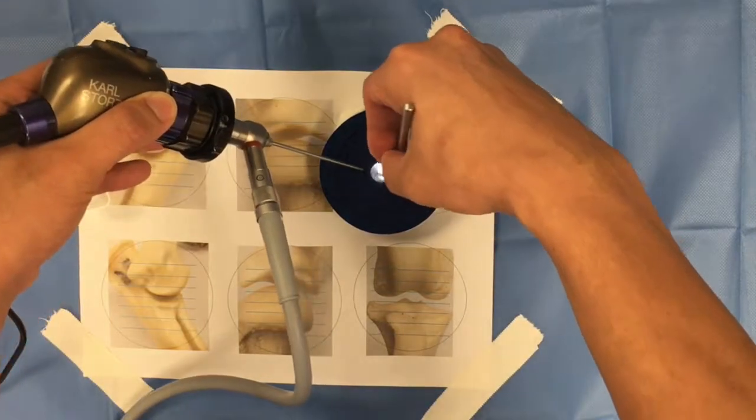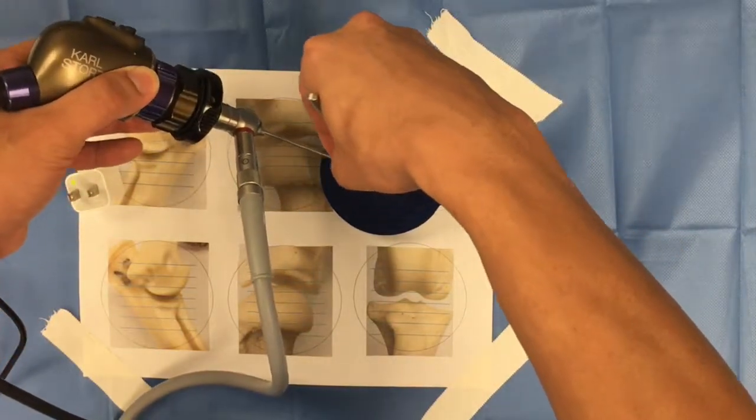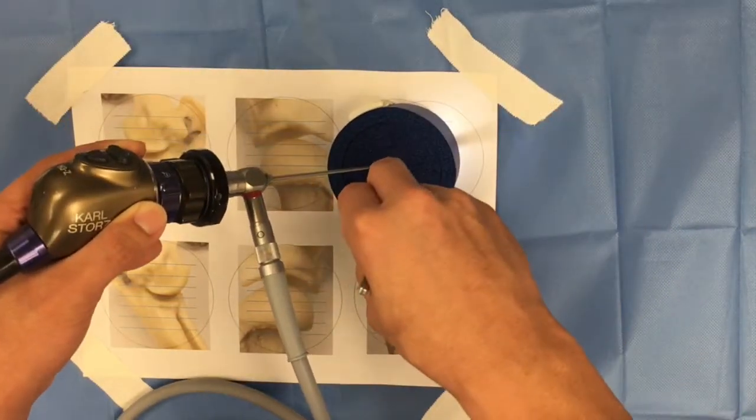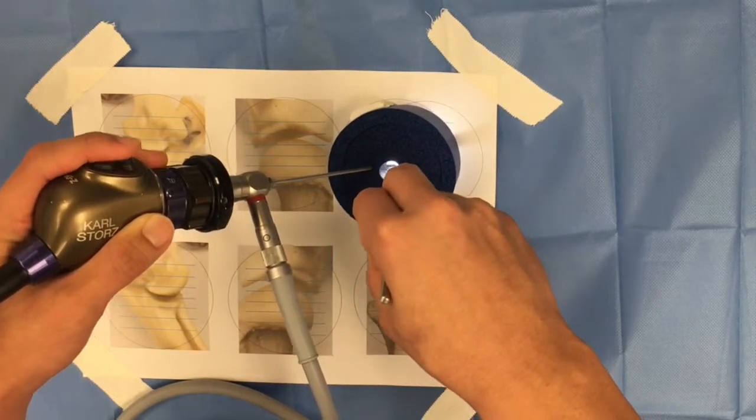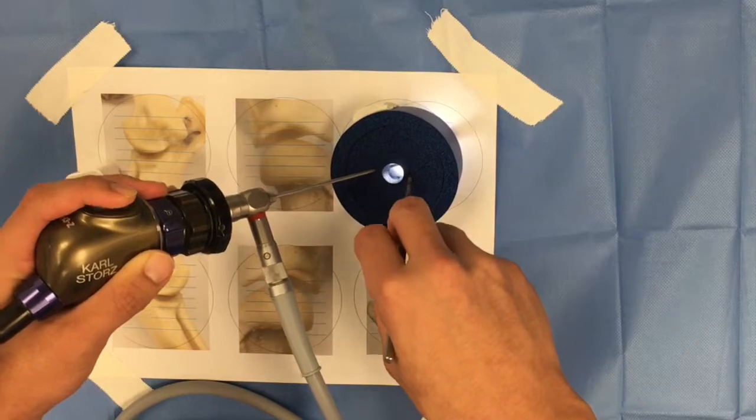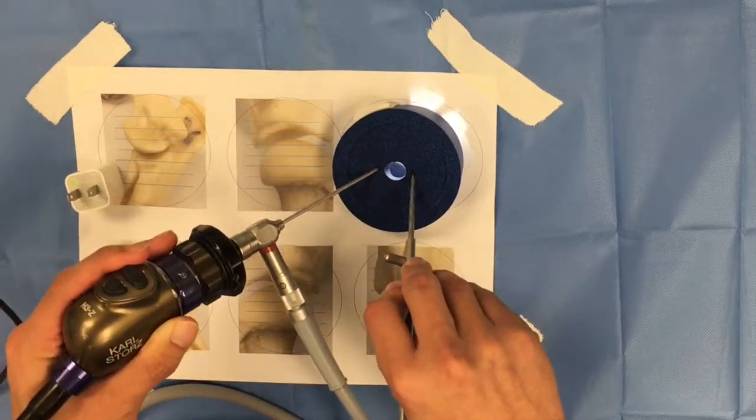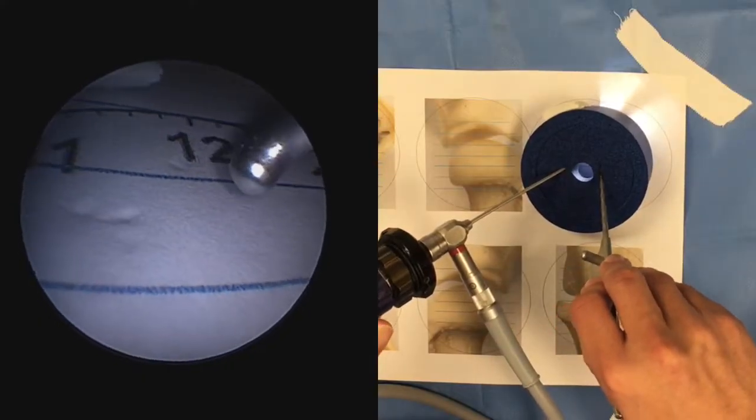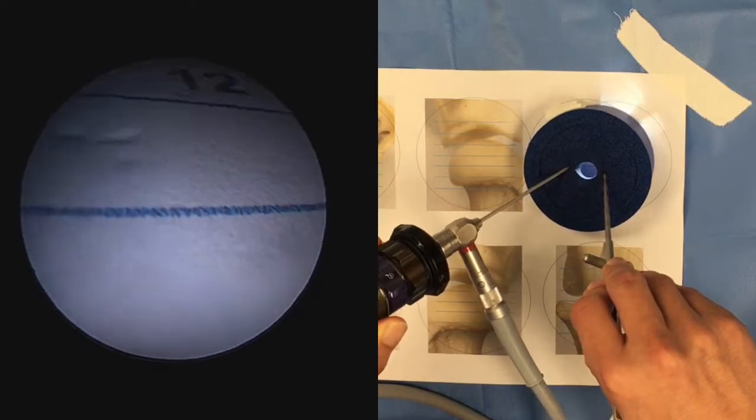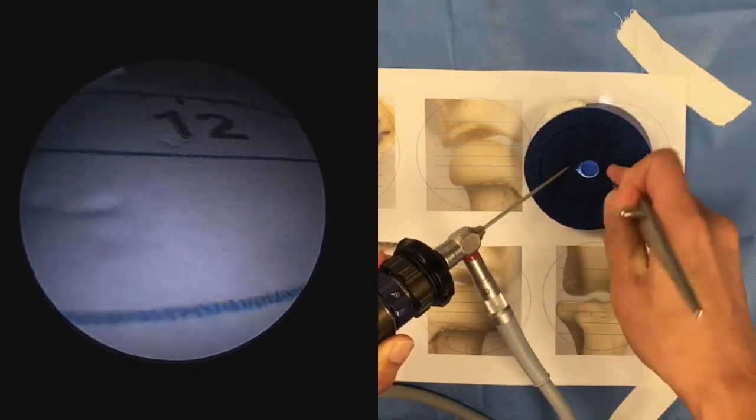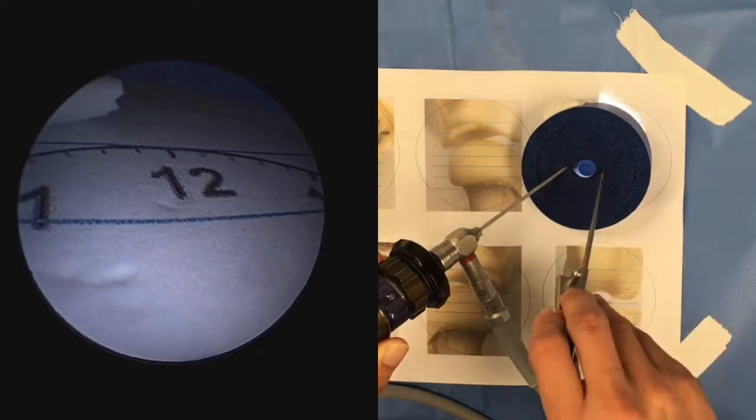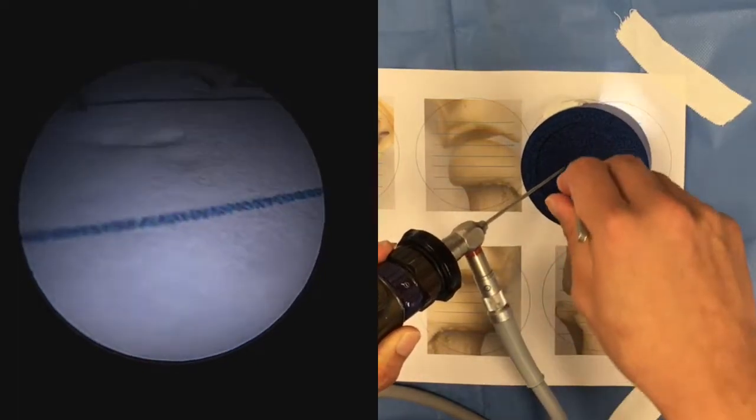In this exercise we are practicing triangulation with an instrument in the first case a probe. It's called triangulation because we have to angle the probe or instrument relative to the arthroscope in a triangular manner. What I'm showing you first is that it can be quite difficult to triangulate or find the tip of the instrument if the field of view is very small.